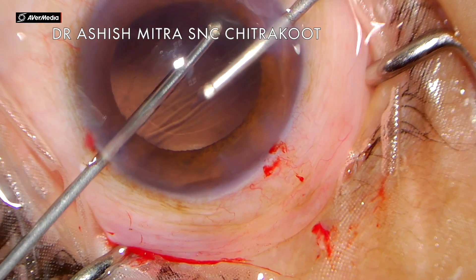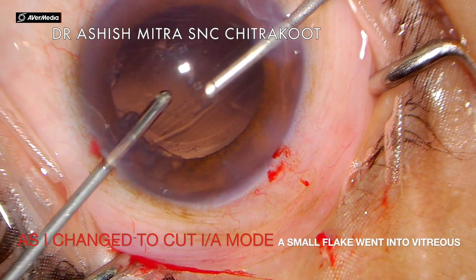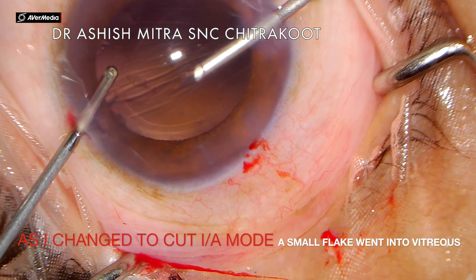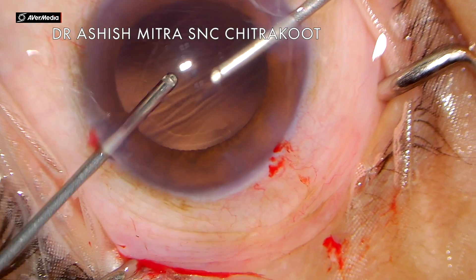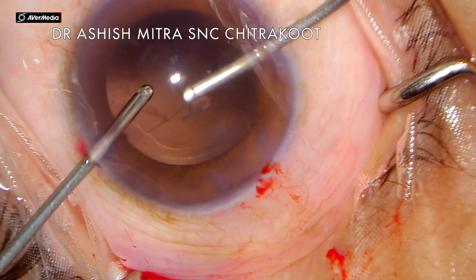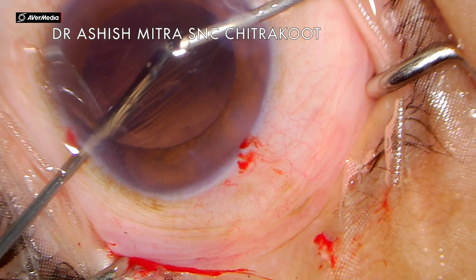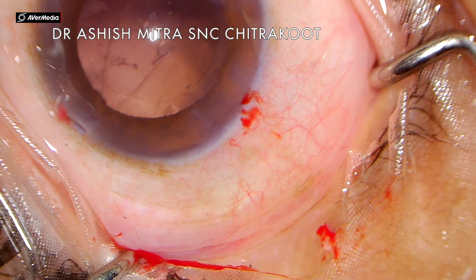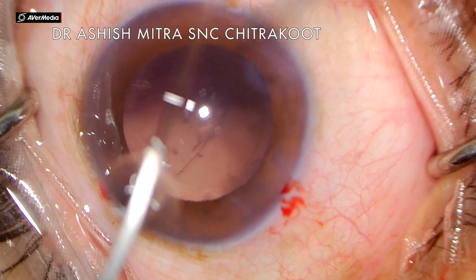Now I change hands to remove cortex from the other side. As I was aspirating this cortex, I suddenly changed to cut IA mode to cut it, but there was a very small flake of cortex that went into the vitreous cavity. This is a very small flake, but ideally this should not have happened. If I had continued in IA cut mode, it would have been fine, but switching to cut IA mode caused breaking of that small cortical remnant into pieces, and one of the flakes went into the vitreous cavity.